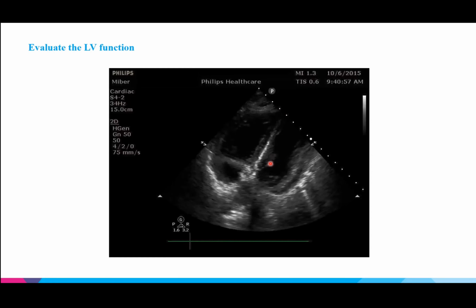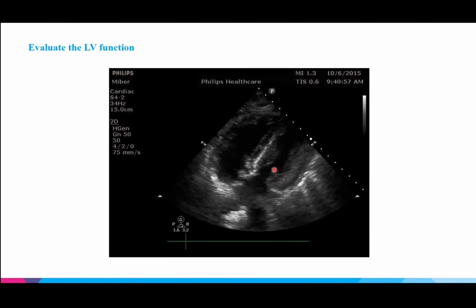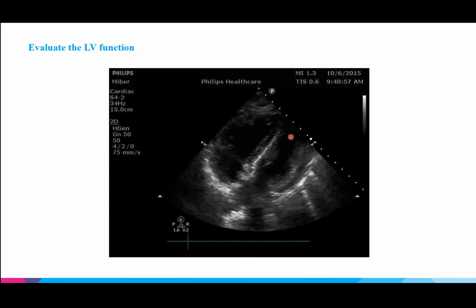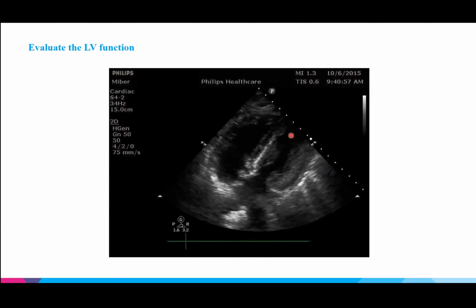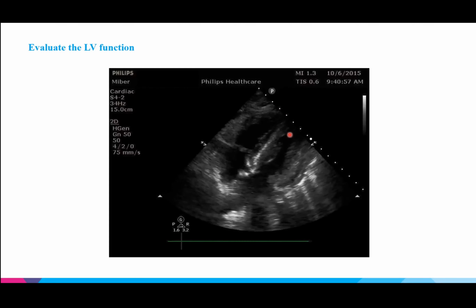But if we're just paying attention to the left ventricle, we're looking at the movement of the left ventricle, right? And in this view, again, the cavity almost gets completely obliterated, right? The walls are moving in fully, and the anechoic or black area is completely going away. So I think for LV function, it's probably hyperdynamic, but I assume this patient had the POCUS for other reasons.